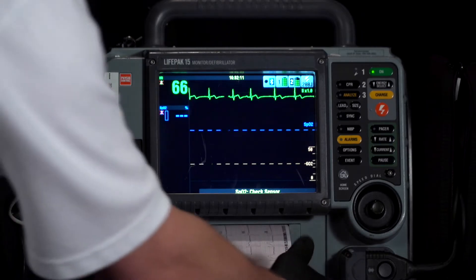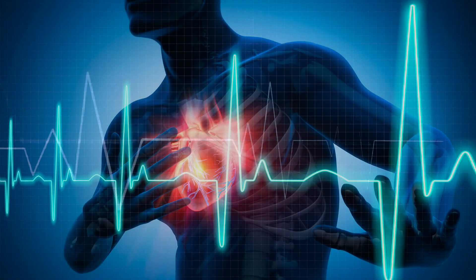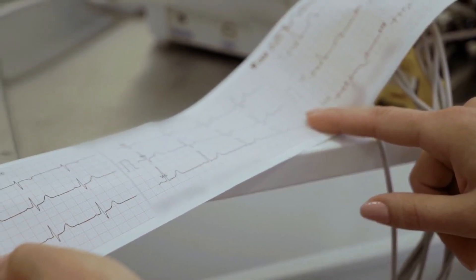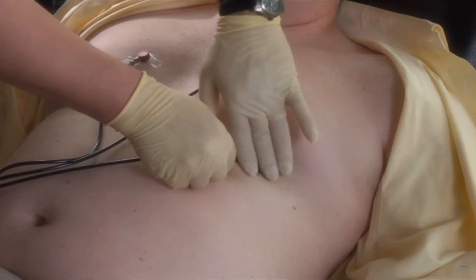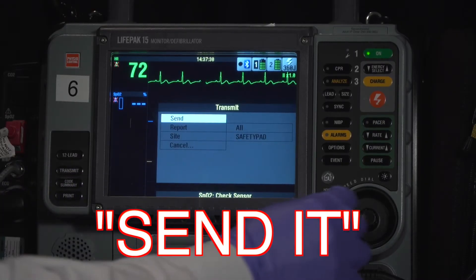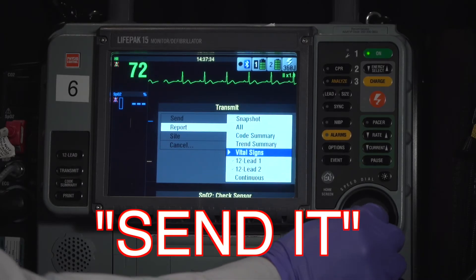If you see the LifePak print out a 12-lead automatically, you need to pay attention to it. If the LifePak has not printed out a 12-lead automatically and 10 minutes have gone by, go ahead and print out another one. Obtain that second 12-lead EKG and compare it to the first. Serial 12-lead EKGs are crucial to early identification of a STEMI. If the patient is having an active STEMI, it's important that you transmit that EKG to the hospital immediately.